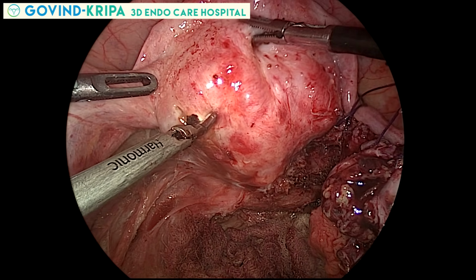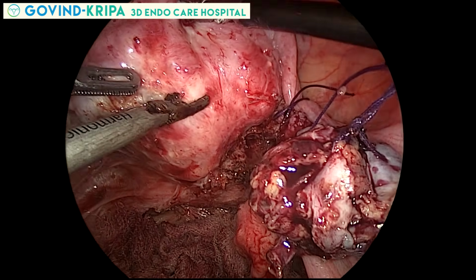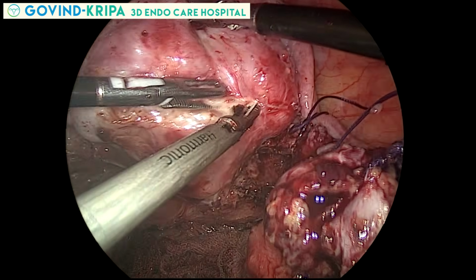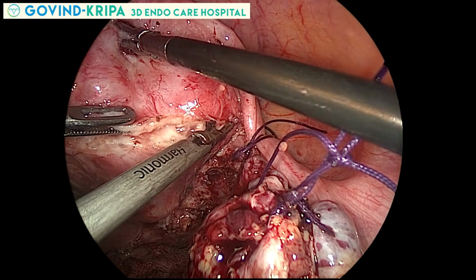In the next part, we move towards the adenomyomectomy. So we take the transverse incision over the posterior wall of the uterus near the fundus, and this incision is deepened a few centimeters till we traverse through the adenomyotic tissue.